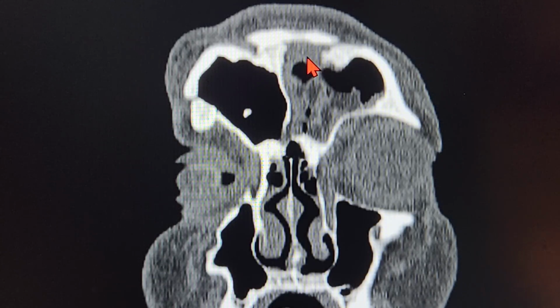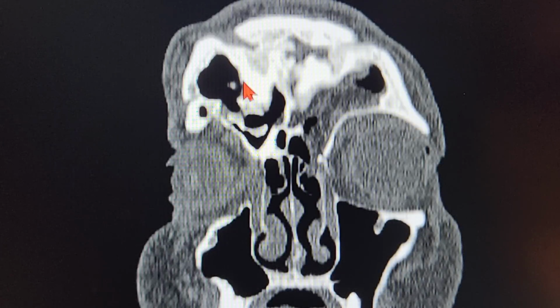Two different densities over there. And you can see there's multiple abnormalities in the surface of the sinus area on the top side. As I keep going behind, you can see there's a lot of rough new bone formation. Probably this is mostly looking like osteotic changes in terms of healing.